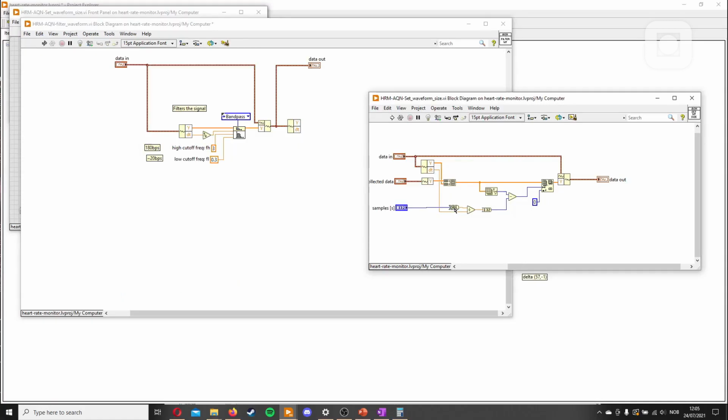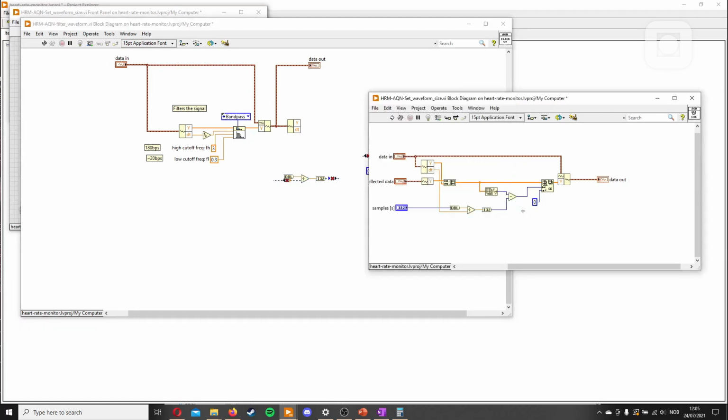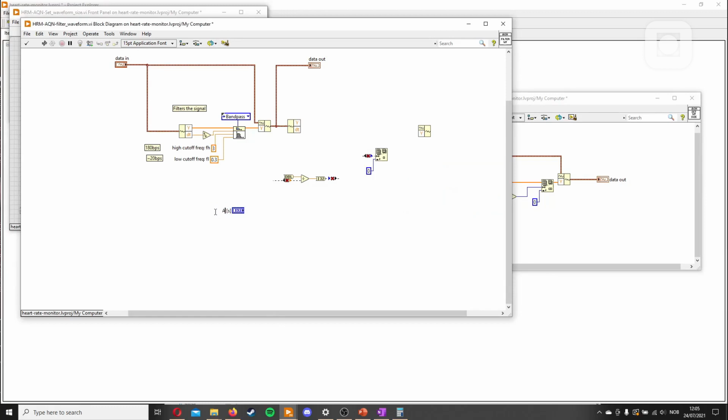We can copy paste this. We could make a VI here which said remove it, but we won't. We're not so interested in the total size here. So what we're interested in is this part and this part. So we'll copy this, put it here. So what we also need is we can have this indicator too, just for ease. And we'll call it additional signal to remove.